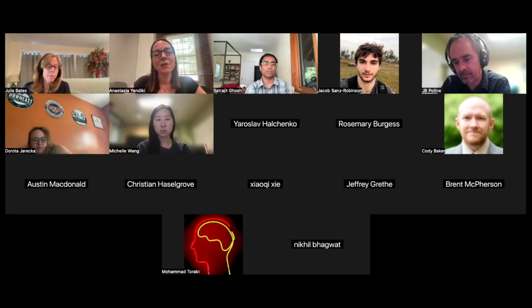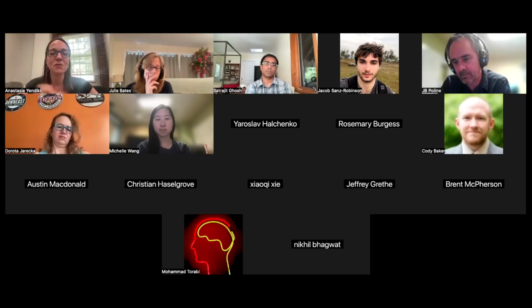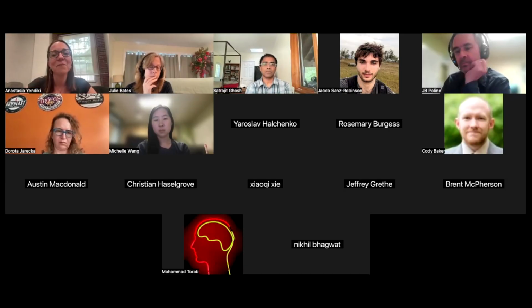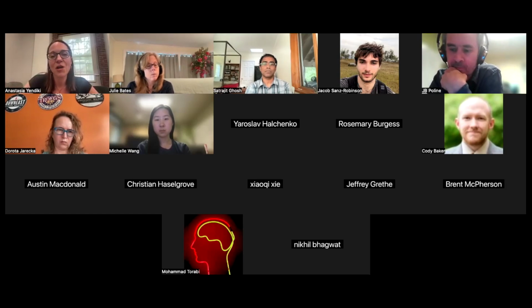Yeah, there's a lot that is challenging for these areas. First of all, they're deep in the brain, so the SNR is always lower. Even with our highest resolution in vivo data, the cortical connections tend to be easier to study than some of these, especially the brainstem connections. And when it's in vivo, there are also other physiological artifacts. So I'm not saying that we're going to invalidate everything, because some of the stuff that has been shown in vivo actually does agree with the tracer literature.